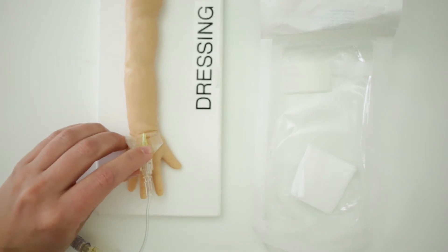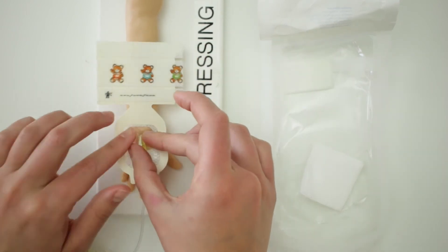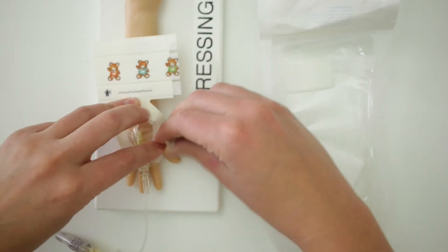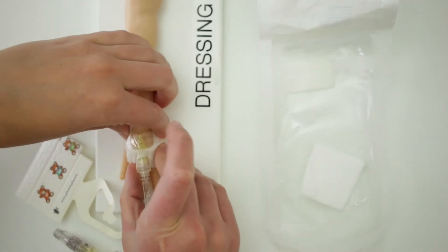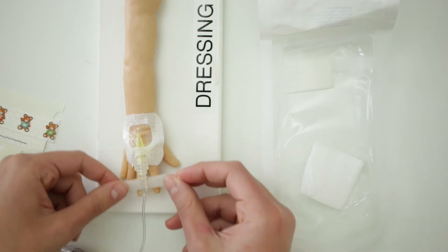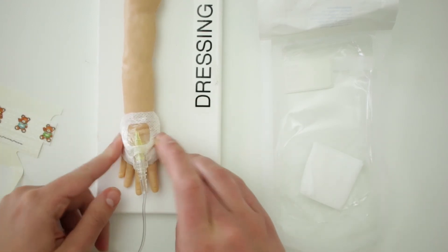I'm now going to take my neonatal dressing and put it over this catheter. It's really important that in the small clear window in the center of the dressing, you are able to see the majority of your IV insertion site. I typically leave a little bit of the catheter in the window so I know exactly where my insertion site starts. After the dressing has been placed, I typically will take another small piece of tape and put it behind the dressing, on top of the wings and at the end of the dressing, to provide a little bit more stability before I start taping the rest of the IV.